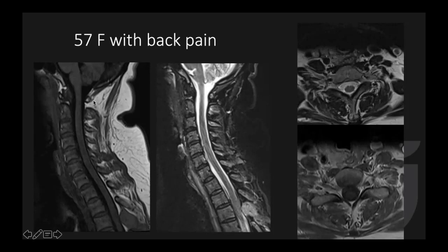Another patient, 57-year-old with back pain: notice metastasis to the spinous process of the upper thoracic spine. It could be from breast, lung, or renal cell — but look for the thyroid. There is a mass extending from the right thyroid gland into the tracheoesophageal groove, pushing the cervical esophagus to the left. This is thyroid cancer metastasis. She didn't know she had thyroid cancer and just presented with back pain.